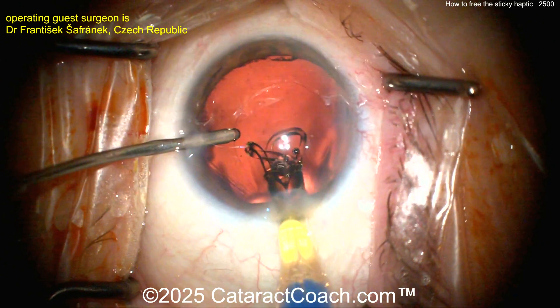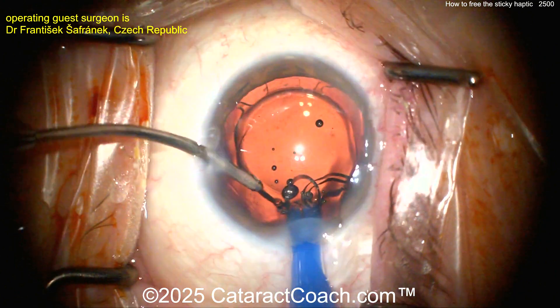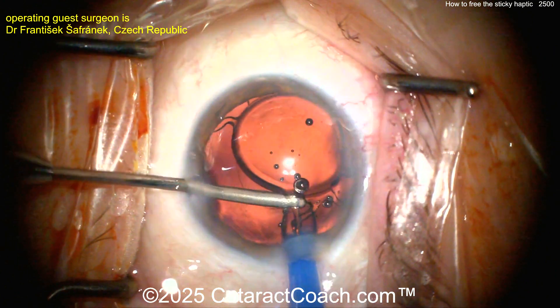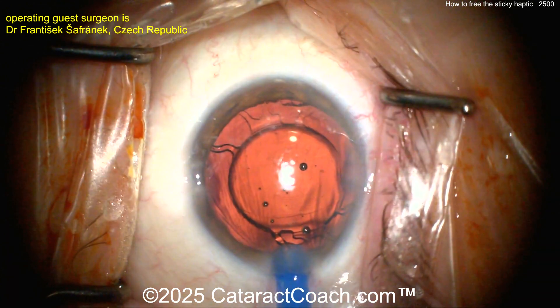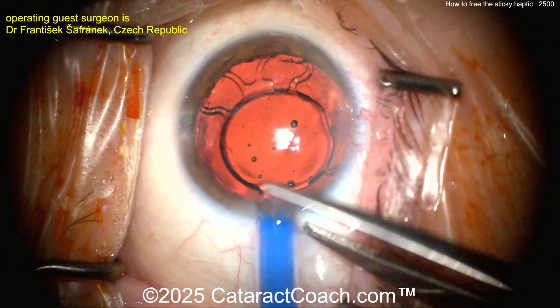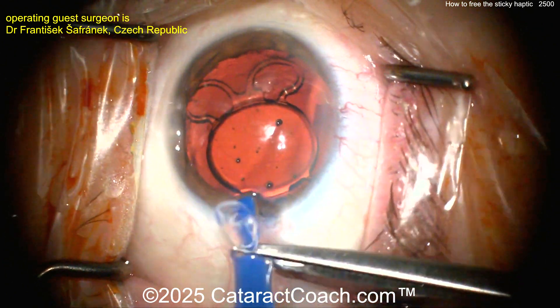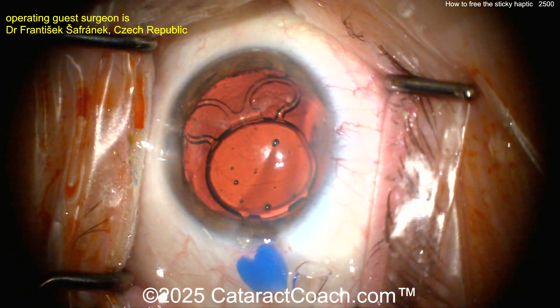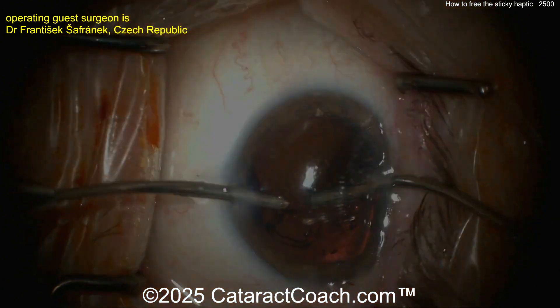Deliver, deliver, deliver — looks pretty good. At the end here, one of the four haptics gets stuck in the injector, and if you yank too hard you're going to break it. So what do you do? This surgeon had an idea: use scissors and cut off the tip of the disposable injector right about there. It won't damage the haptic — in fact it'll release the haptic. There it is, it's been cut. Now you can push it back inside the eye and once it's inside the eye, you're done with the case.